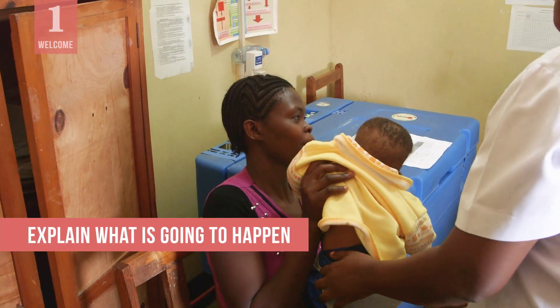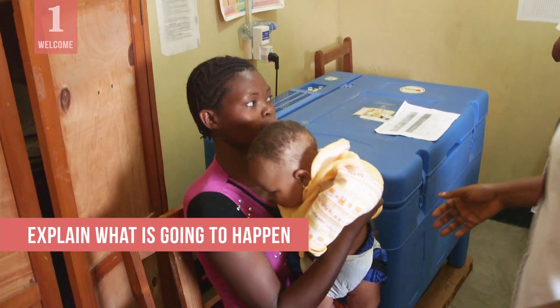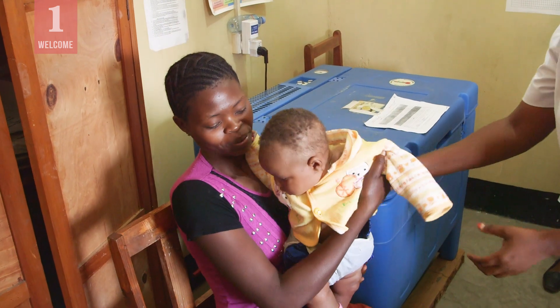Explain to the caregiver what's going to happen and talk with them about the best way to position their child.